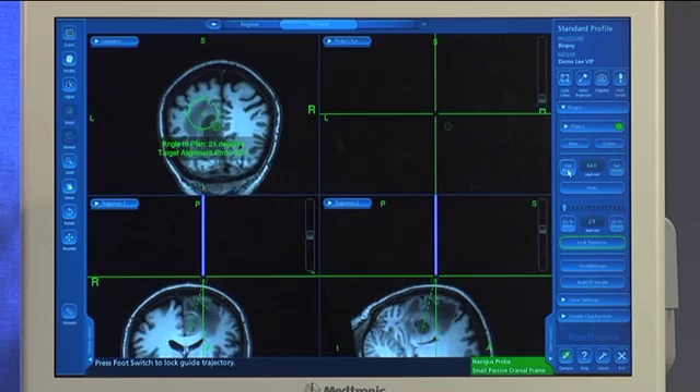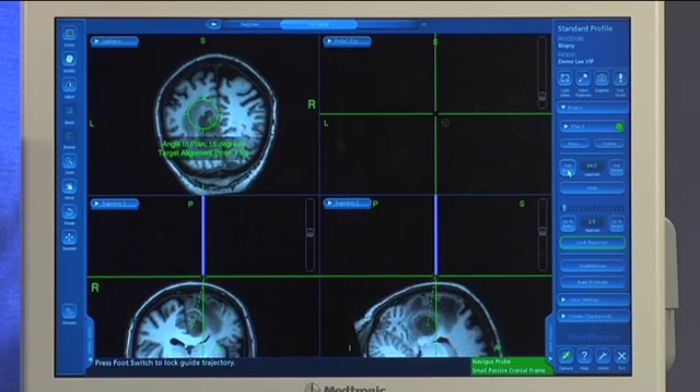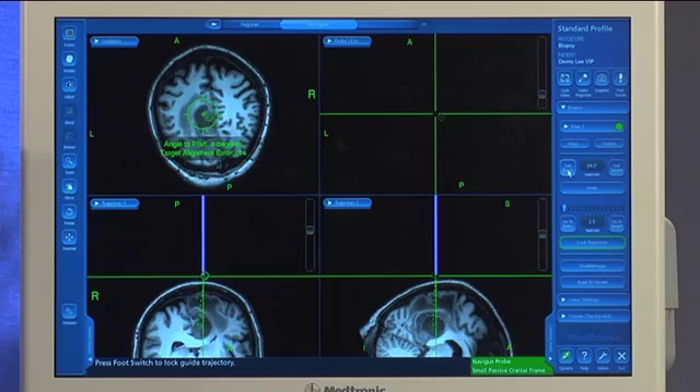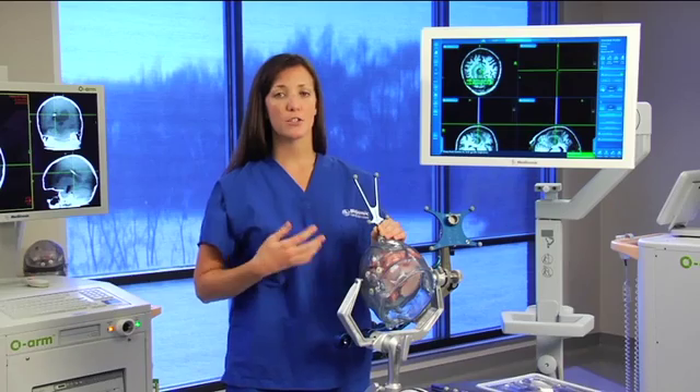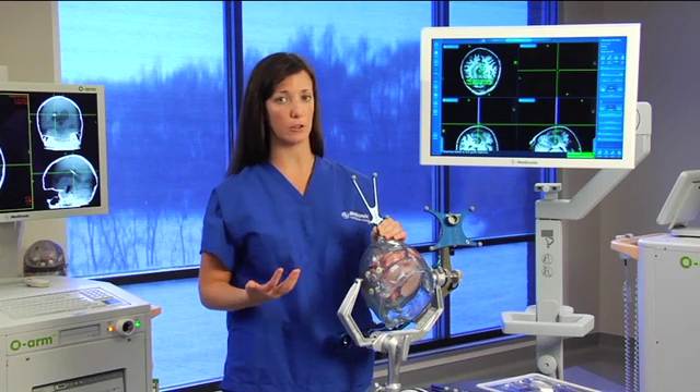You'll notice that my views have switched to trajectory views and a probe's eye view. What I'm going to do now is align my Navigus probe perpendicular to the skull at my planned entry point. That's going to identify an angle to plan so that I can determine whether I want to use the straight Navigus base or the angled base.